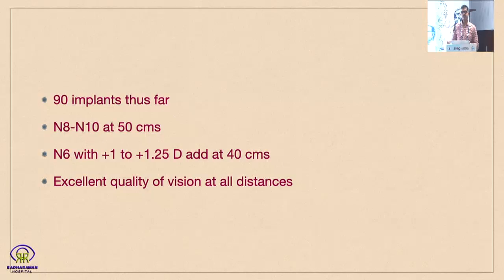So the quality of vision is supreme, and intermediate vision is very good, hardly requiring any assistance of glasses for intermediate, and for near they need a minimal add of around +1. Max can go up to 1.25.